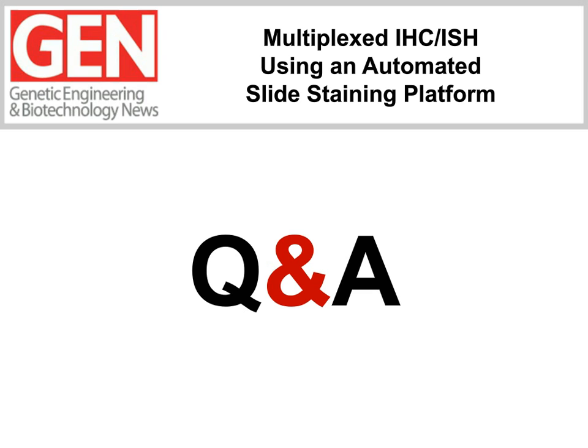Yeah, that definitely would be feasible. The one recommendation I have, if one were to attempt this, is definitely use the enzymatic deposited fluors first. That way, they're not affected by your elution methods. And then, if you're going to be coming in with secondaries, if they're anti-hapten secondaries or anti-species secondaries, if your elutions were effective, there shouldn't be any cross-reactivity going on there.